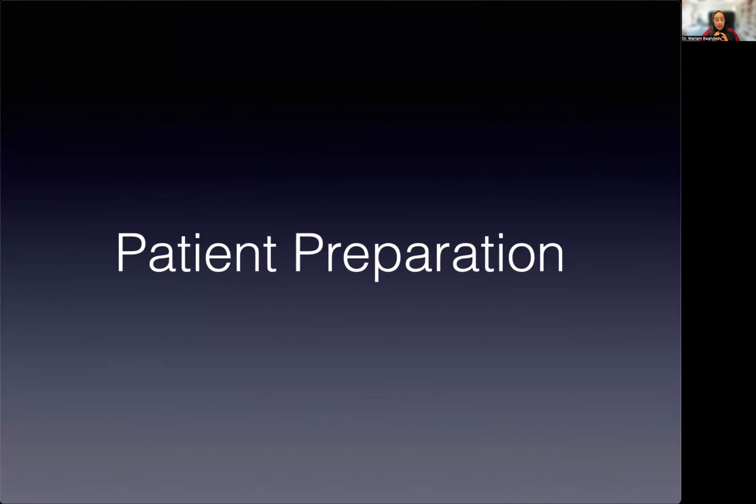Okay, so patient preparation is going to be important. So remember what we said before. The first thing we're going to do is explain the procedure to the patient. We're going to tell them what's going to happen, give them a brief overview that this is going to go around your head. You're going to have to be still for the entire time. If somebody needs to take a sip of water or whatever, just tell them all of these things before you start preparing the patient to get in the machine.